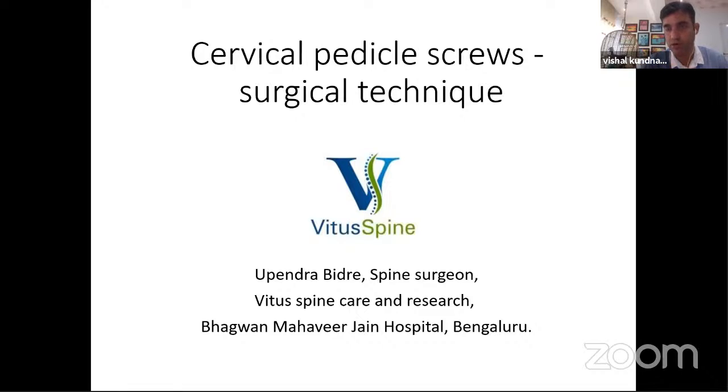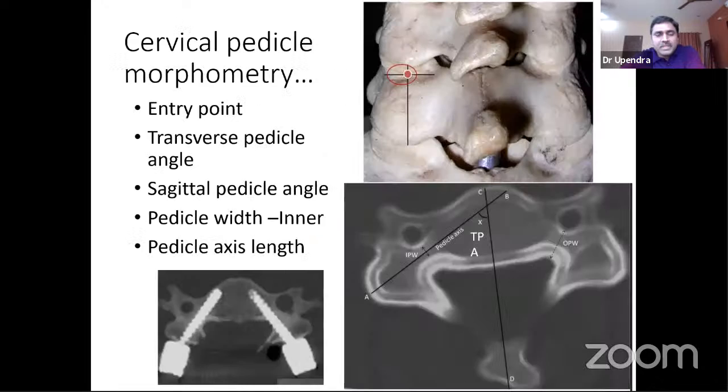We will come back to you, Ayush. Please stay back. We have plenty of more questions coming up. We'll be catching you again while we move on to a far more secure, little more ambitious and challenging technique, cervical pedicle screw. Over to you, Upendra. Thank you. So I'll be speaking on cervical pedicle screws surgical technique.